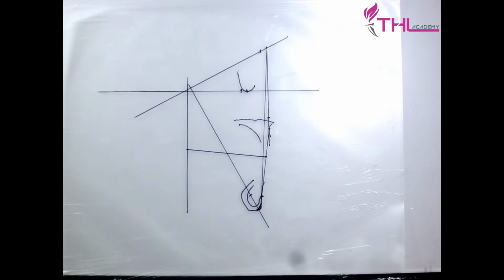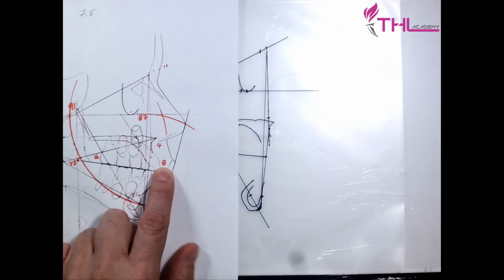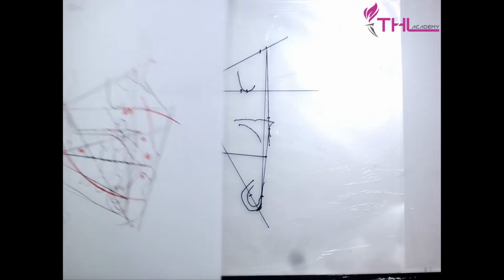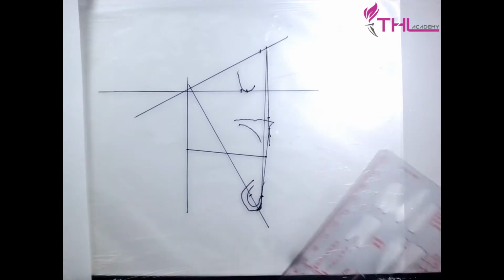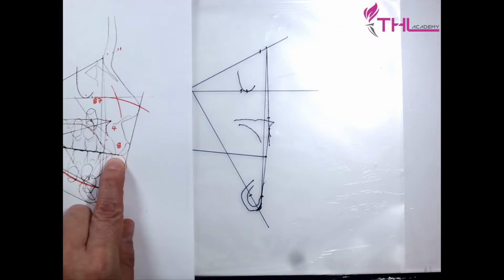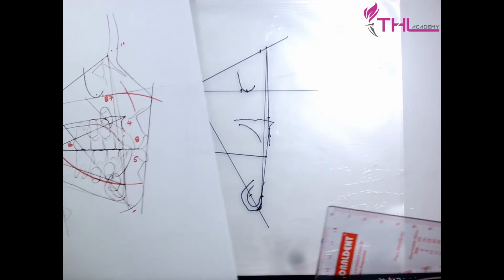So now we have to decide where I am going to finish. Remember, this tooth is 8 millimeters forward, and I want to finish at 6. I see here also the level, and I take into account that I like this level because it's almost at the commissure, maybe a little bit down. It is very beautiful like this because it lies right at the corner of the mouth, where the two lips join.